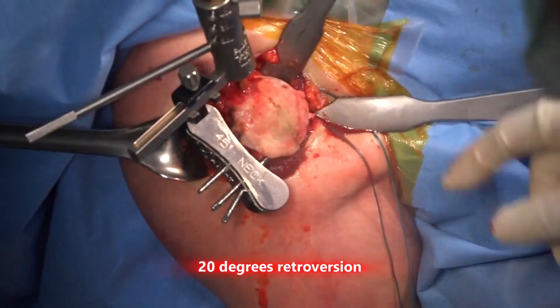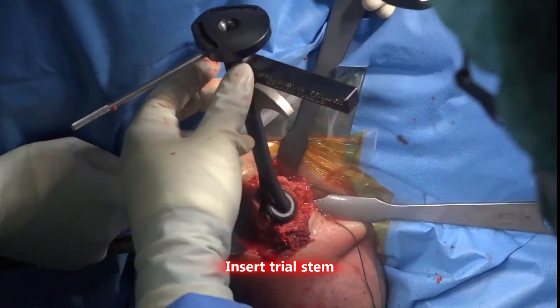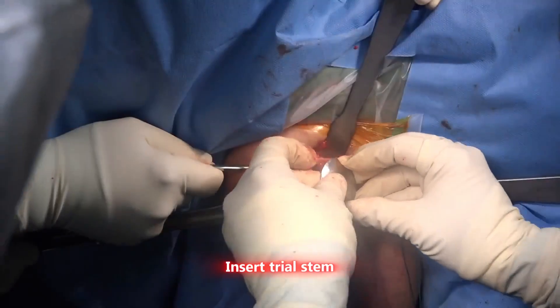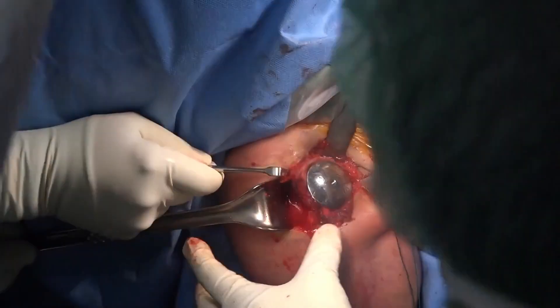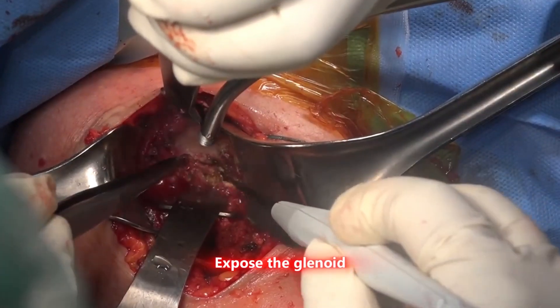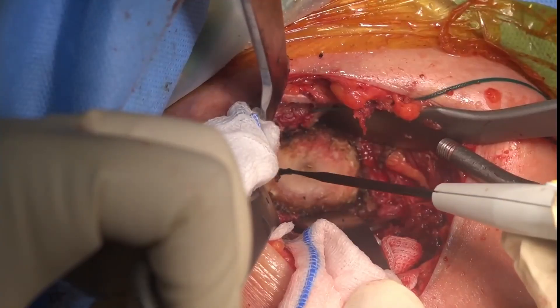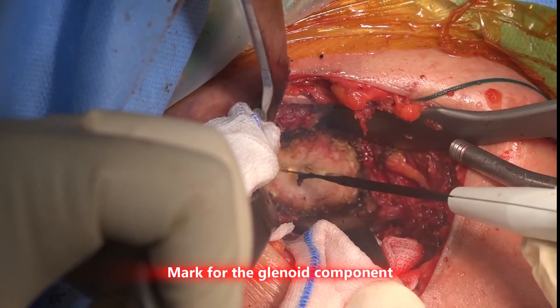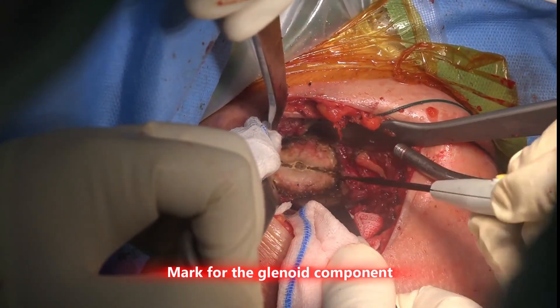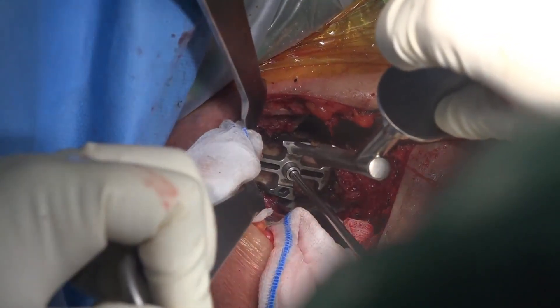Check the version and then cut the head.